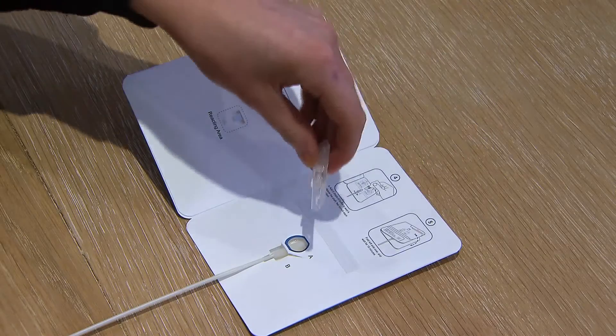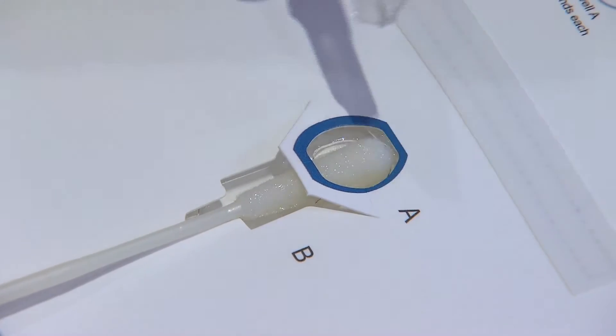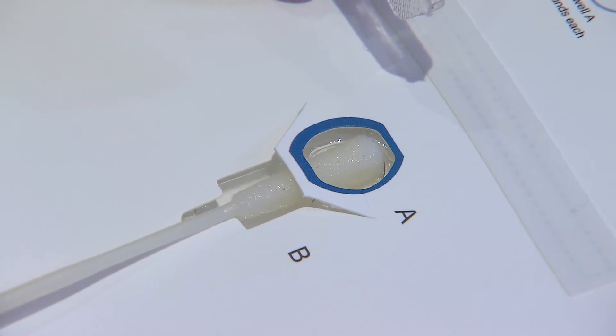Step 4. Add 6 drops of solution into cavity well A and then rotate swab stick twice in each direction.